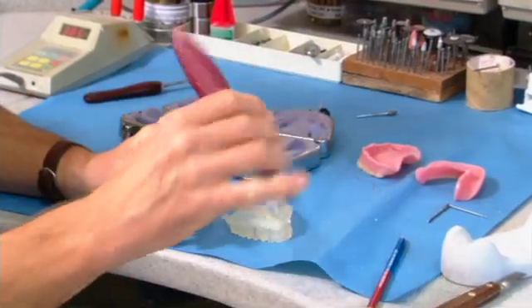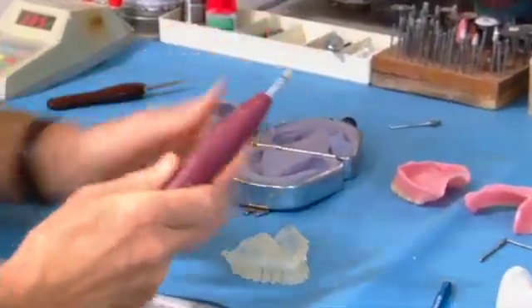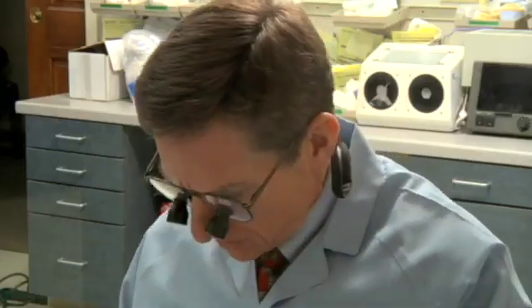So I'm going to use a large acrylic burr. This is a Brasseler E-cutter burr, and you'll see how fast I'll be able to take off this excess.